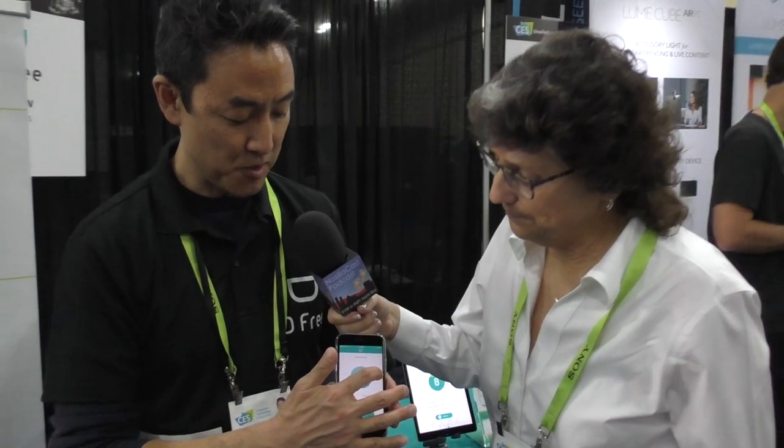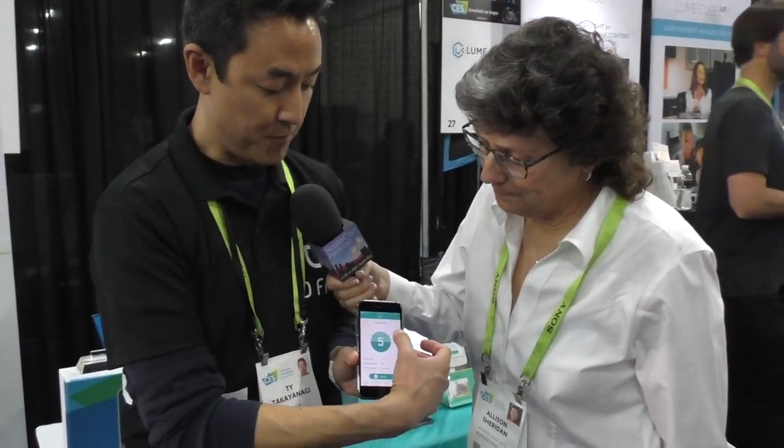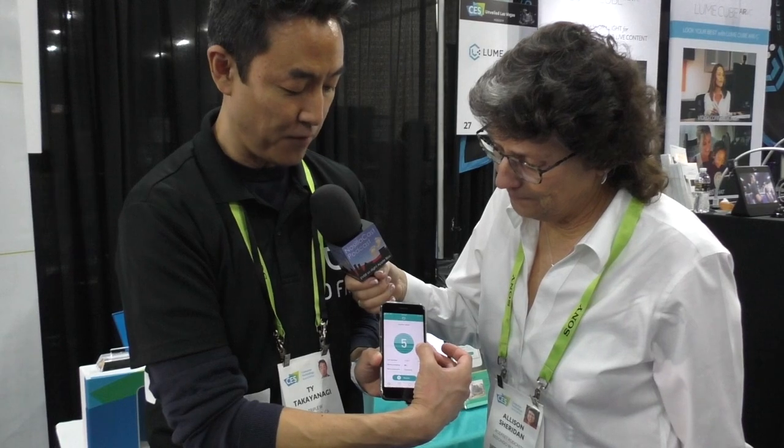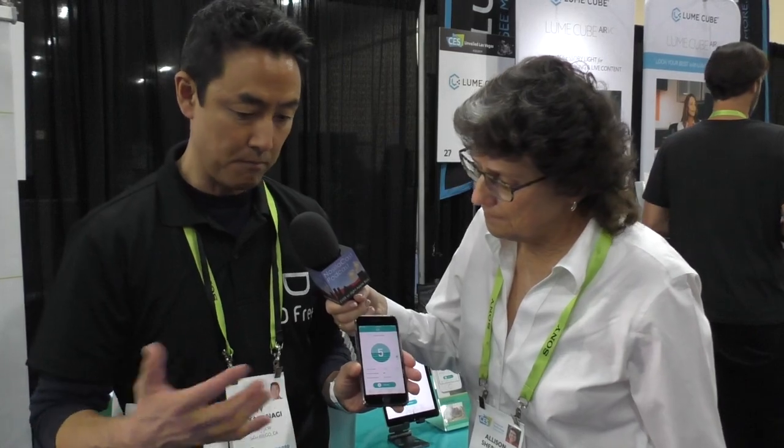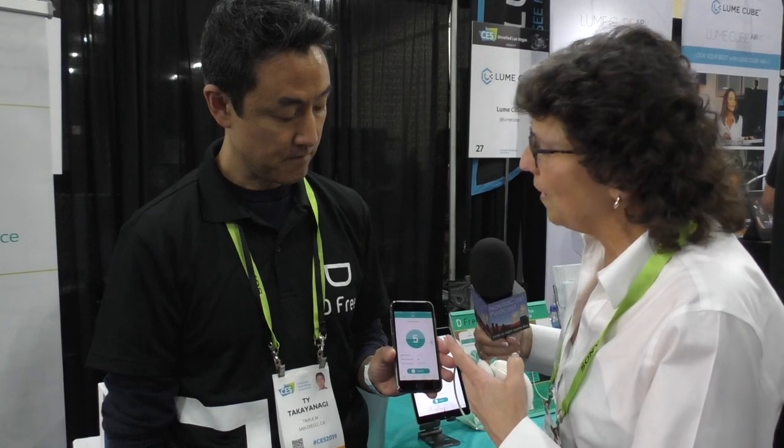There's a notification threshold control in the app. You can set it so that you get a notification when your bladder is 40% full, 50% full — whatever gives you adequate time to find a bathroom when you're out and about. It really depends on the person; some people go to the bathroom when it's 50% full, and his seven-year-old daughter goes when it's at 10%.